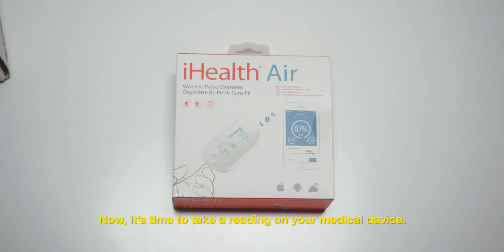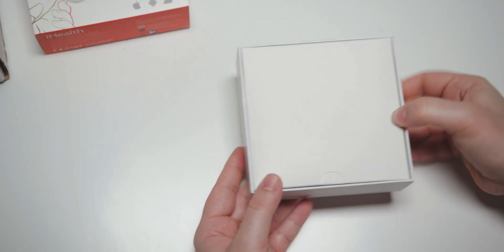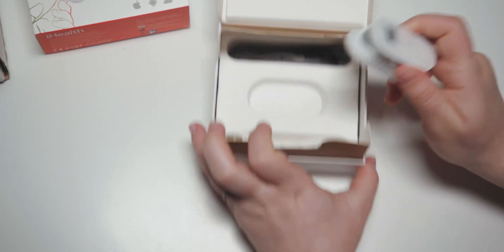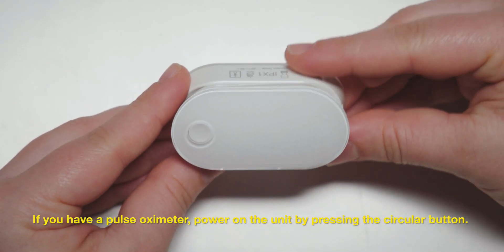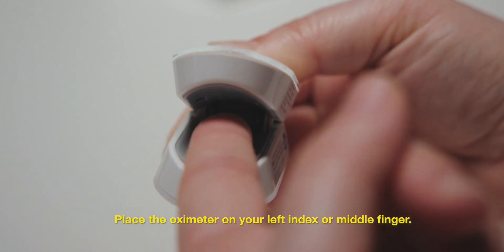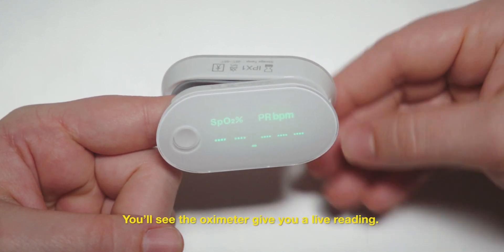Now it's time to take a reading on your medical device. If you have a pulse oximeter, power on the unit by pressing the circular button — you'll see it light up. Place the oximeter on your left index or middle finger. You'll see the oximeter give you a live reading.